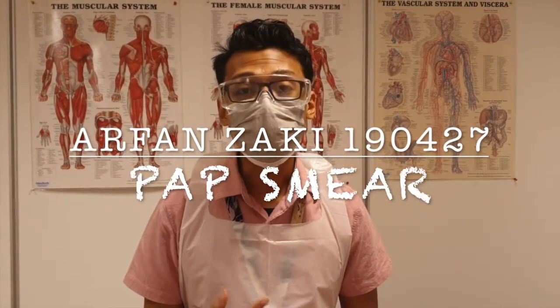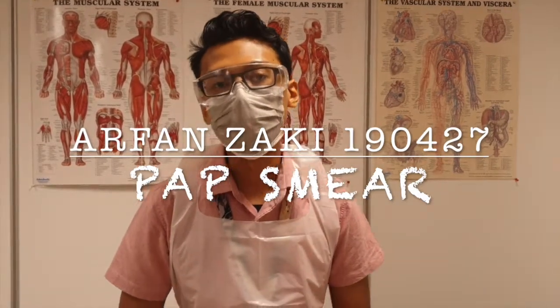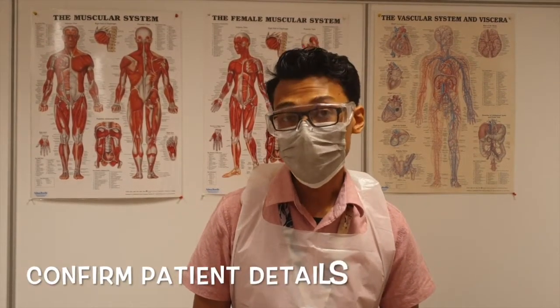So today, my name is Muhammad Arfan Muhammad Zaki. Today I will be demonstrating the procedure whereby we will be doing a Pap smear. I will go through the details of what we're going to do today. The first thing is that we want to confirm the patient's details. Make sure it's the right patient.